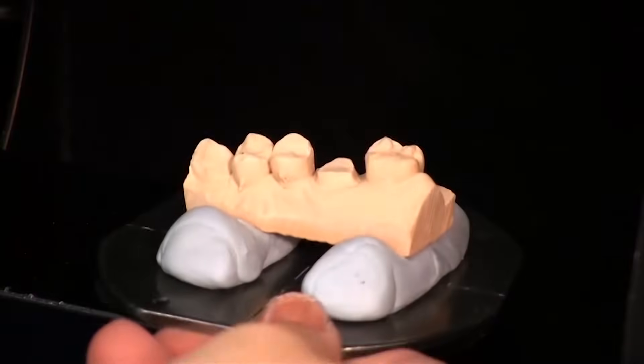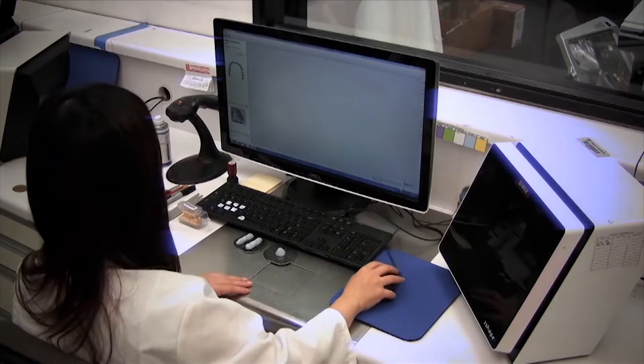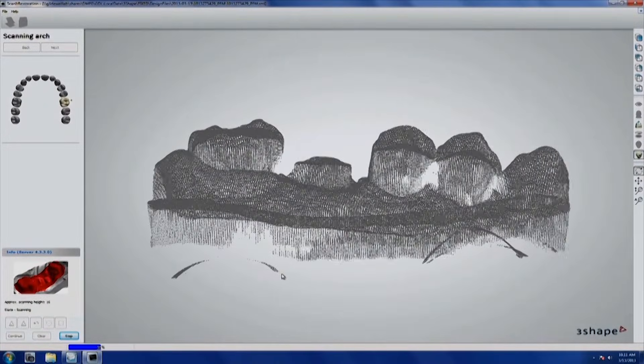And as you can see, this is being put into a three-shaped scanner. We want to get this into the digital environment as quickly as possible because everything works better for us in the digital environment. It's so much more consistent.